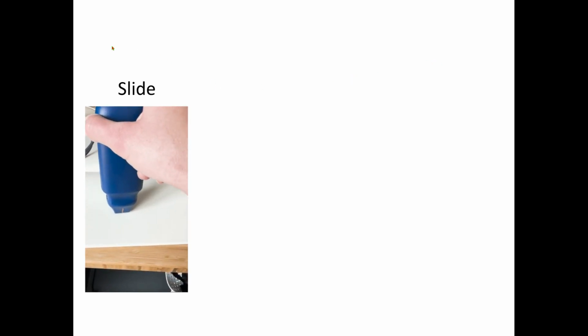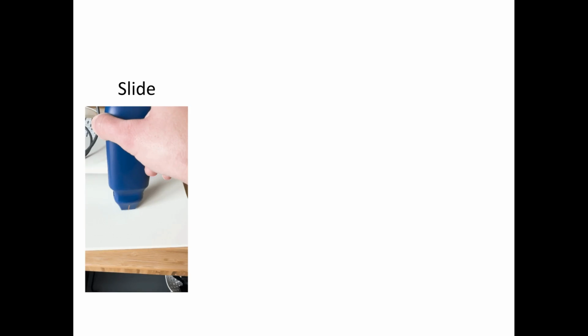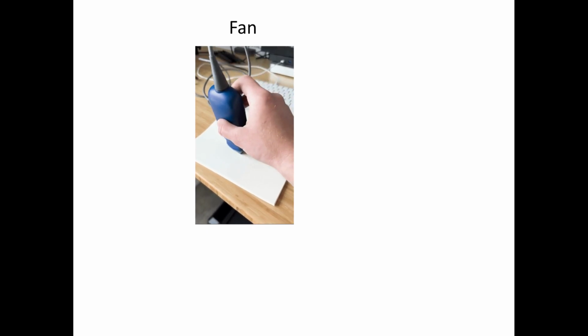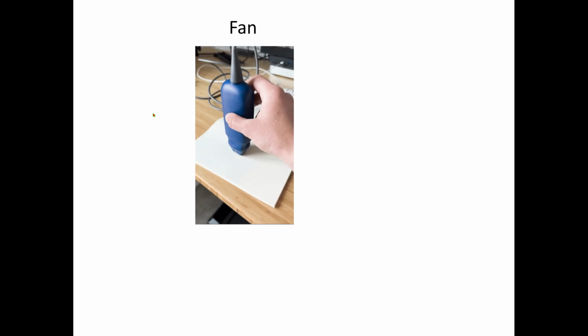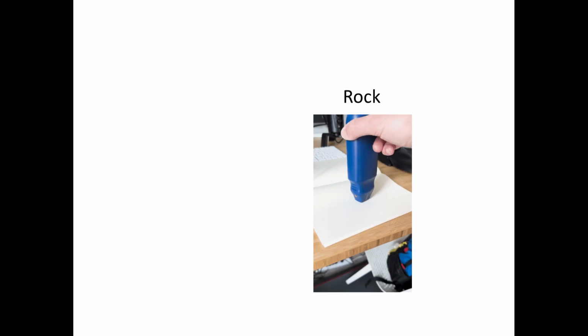There's 4 cardinal motions that we'll mention. Sliding is just translating along a surface, so you're not tilting it or doing anything like that. Fanning, we're imagining a pen is going through the probe marker, which isn't visible in this image, and then we're just tilting it back, tilting it forward. That's to look at things above and below where we're at.